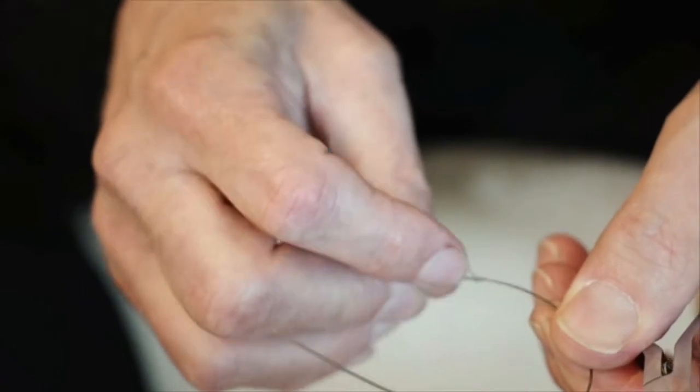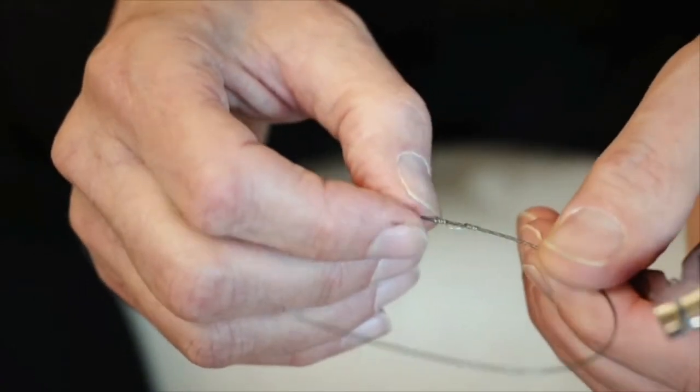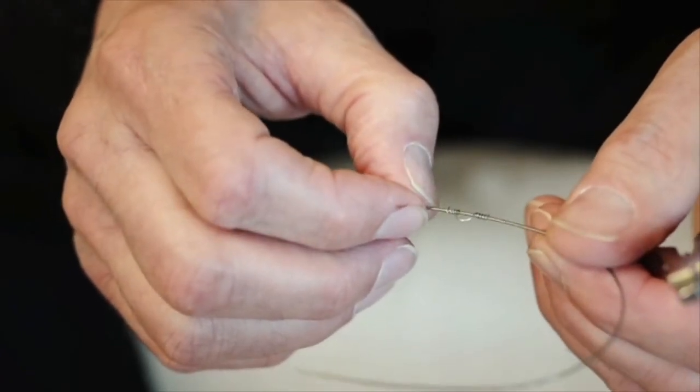Whether you want to do labial crown torque or lingual crown torque, or in a situation where you have a Class II Division II and you need to bring the central roots to the palatal so that they stay stable, it works wonderfully in that particular arena. The other thing to mention is that when you do this you need to figure-eight the six anterior teeth together before you put the spring on. That way everything is held in their new crown positions while the root is moving purely by itself.